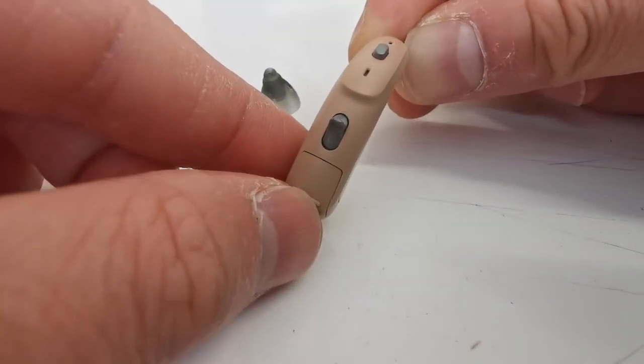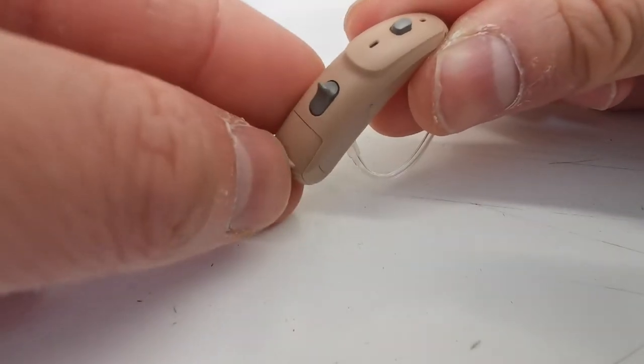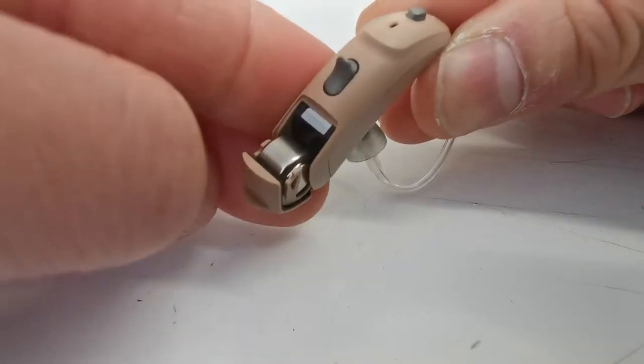You use your nail to pull onto the lip of the battery drawer and simply pull it open.